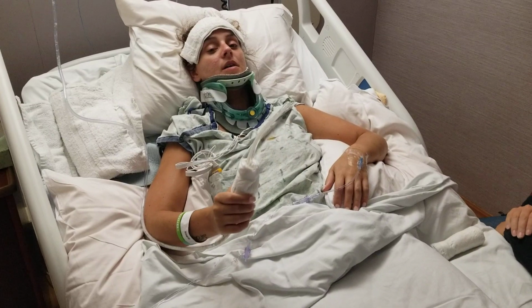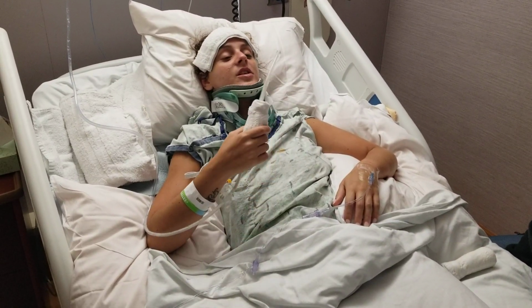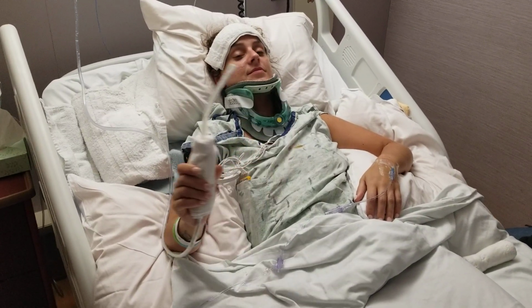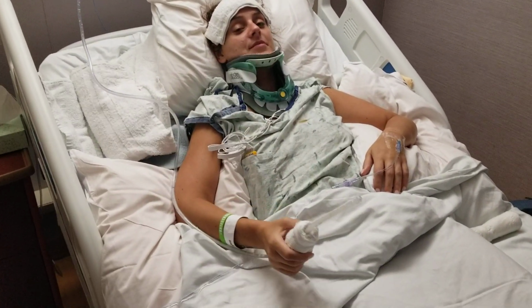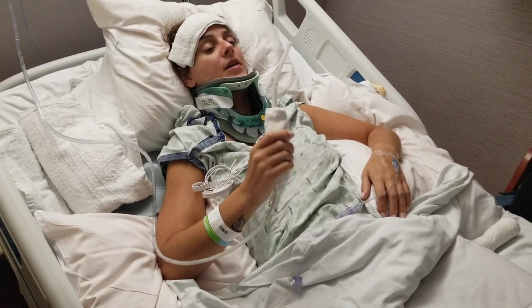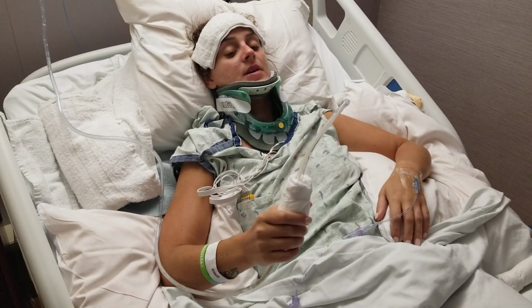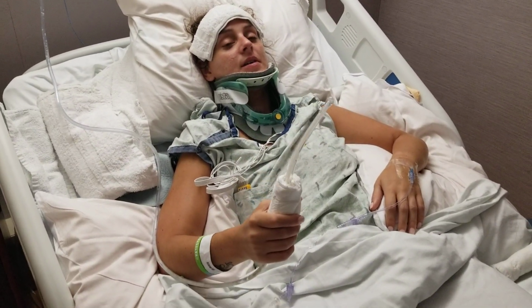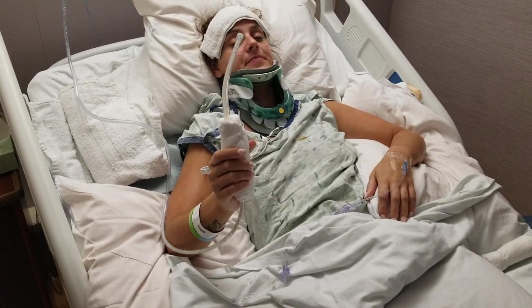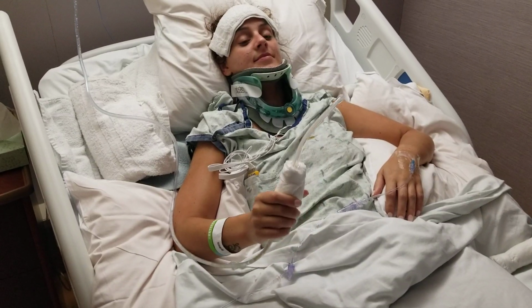All right, we're back. So when Katelyn first started with the suction, she was not able to do anything on her own, and she required assistance to do the suction. And what the suction does is it's getting the fluid and stuff out of her lungs. As of right now, she's not able to swallow, so that stuff's coming up. So right now she's able to use her right hand with the suction, even as a couple days ago she could just barely get it up to her mouth, and now she's moving it all around.